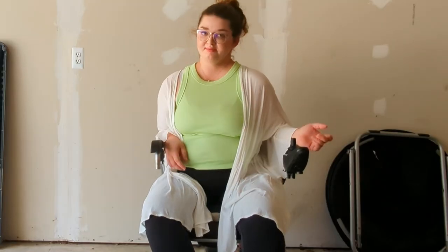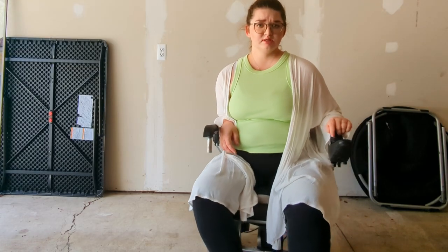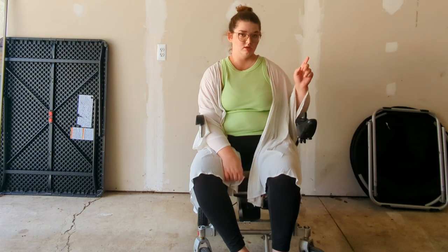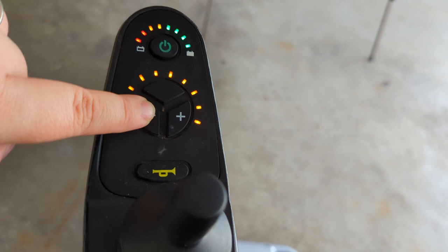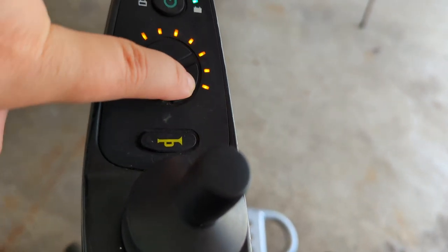Now I'm in my travel wheelchair. It has quite a different turning radius than the other one does. The basic components are the controller — it has buttons that control the chair's functions. There's the power button, and then this dial controls the maximum speed: down for slower. But why would I want to go slower? So I keep it all the way up. This is the horn.